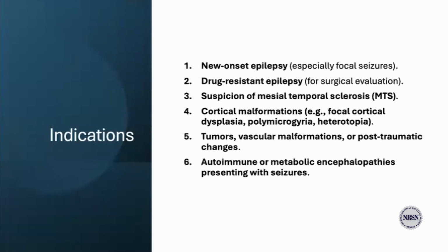In some cases, we are checking for tumors or even vascular malformation or post-traumatic changes that might be triggering the seizures. And finally, it can also help us evaluate autoimmune or metabolic encephalopathies, which may present with seizures as part of their clinical picture.